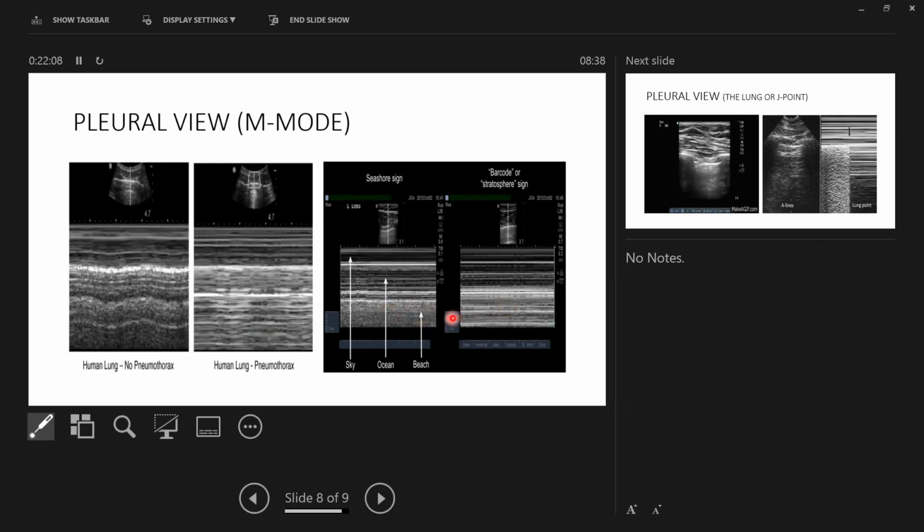Now, when you look at these, the one thing that sometimes can confuse you, because can you see here, this is where the patient is breathing, or trying to breathe. So if you have a patient who's breathing quite fast, then sometimes these little batches can come together much closer, and it can be a bit difficult. It's not common, but it does happen, in which case you should ask for senior help, ask somebody who's got more experience and say, listen, am I seeing what I'm really supposed to be seeing?